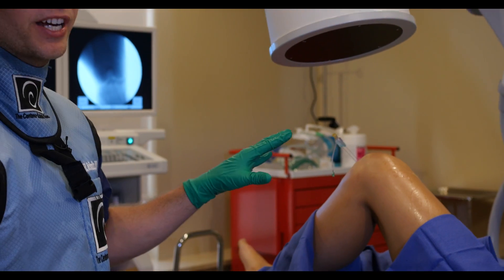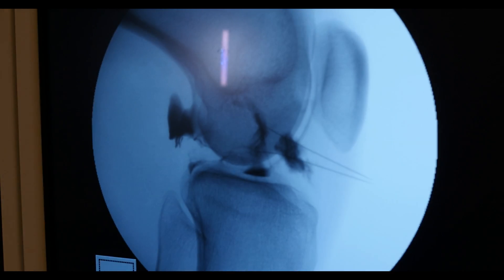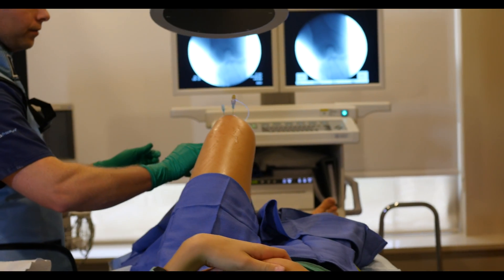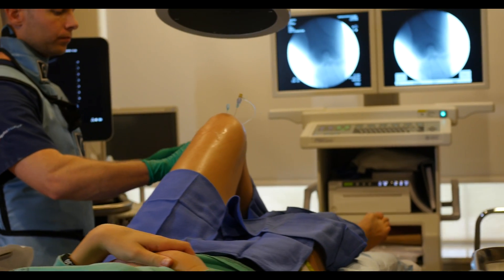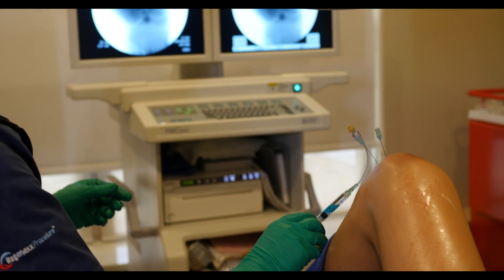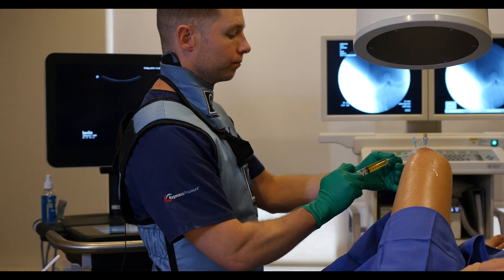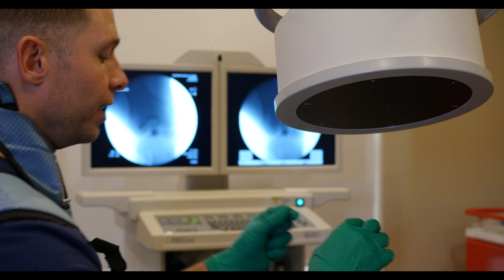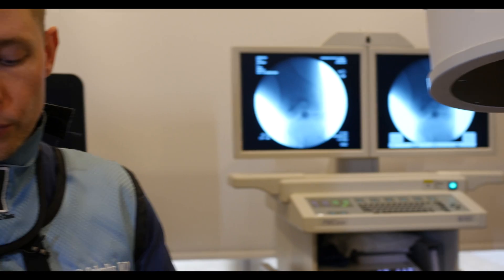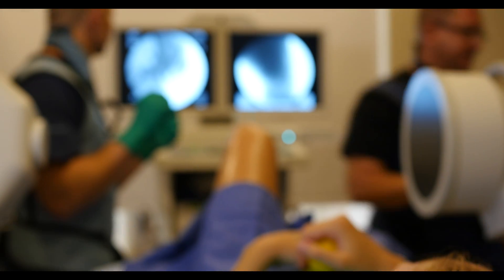This is a precise injection. We use live x-ray guidance called fluoroscopy. On the screen there are two precise needles. We always target the origin and insertion of the ACL, as well as both specific bundles — since the ACL is created by two different bundles. We're injecting contrast dye to map out the ACL. If you don't put a precise injection into the ACL, it'll never get there, because the knee joint is a pretty big joint and the injection itself probably wouldn't reach the area it needs to.